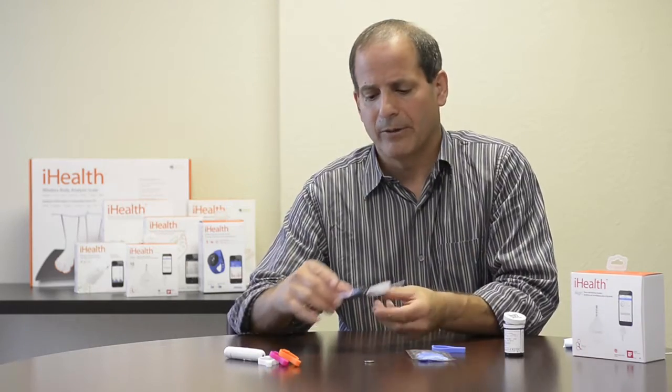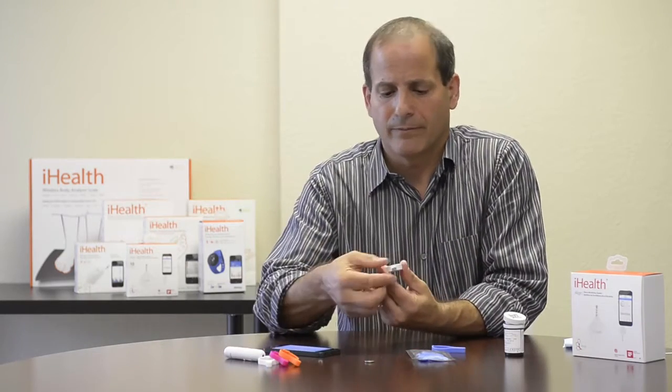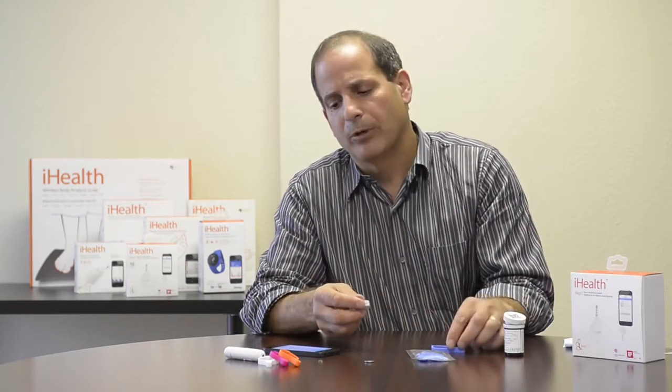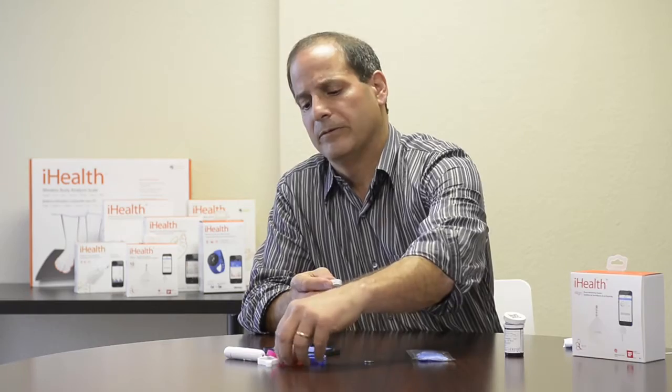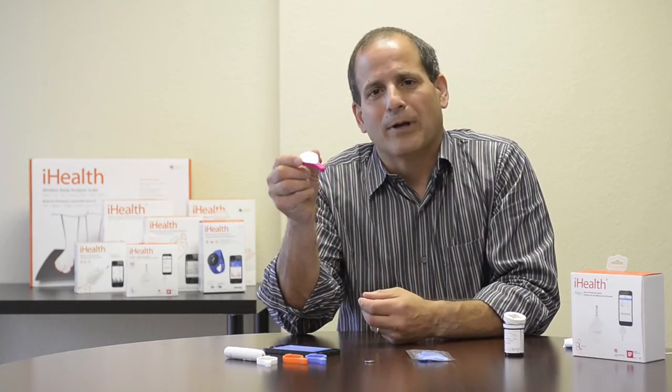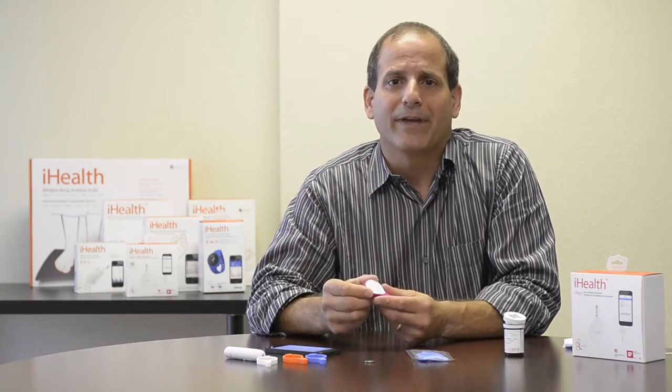Now that I've finished my reading, I just pull the meter out, remove the test strip and dispose of it properly, and put it back in the case. I'm going to use a pink case because I'm feeling in a pink mood. I can drop this in my pocket and I'm ready for my next test. Thanks for listening — if you have any questions, feel free to contact support at iHealthLabs.com. Thank you very much.